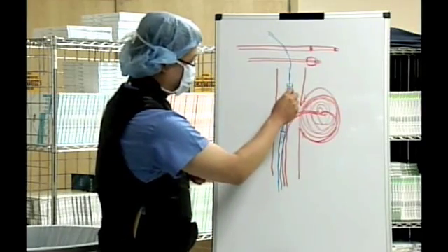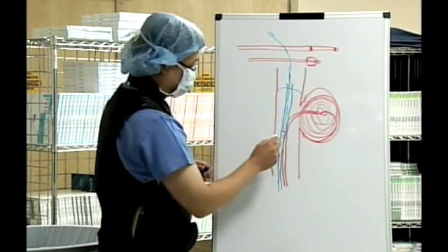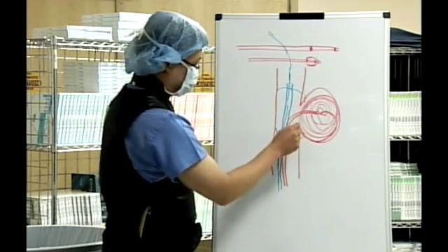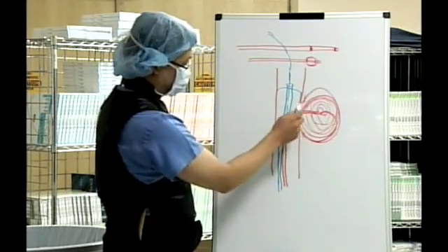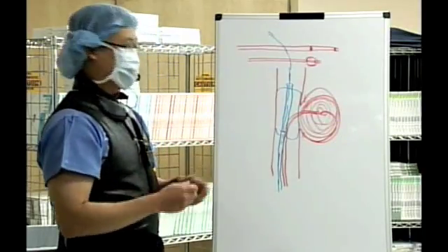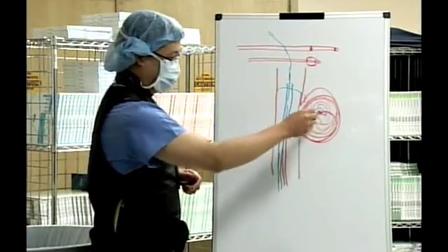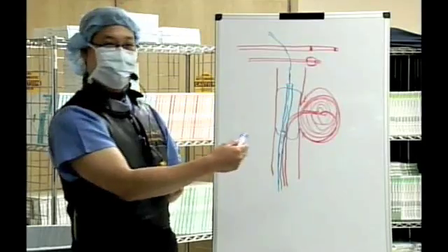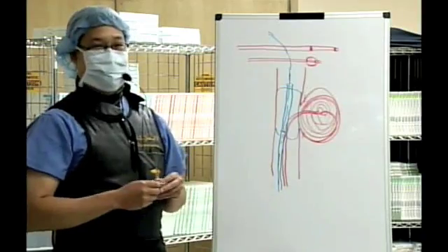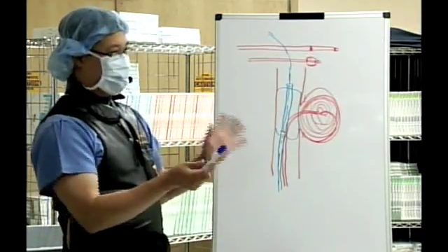But the balloon, what it does and why it's so important is that when it's blown up, or inflated rather, it lays across the neck like this. It's kind of like having an extra finger inside the vessel to hold it so that when you put this coil up, it won't come out. Because obviously if the coil comes out and floats off into here, the patient's going to have a stroke. So basically that's our procedure in a nutshell.